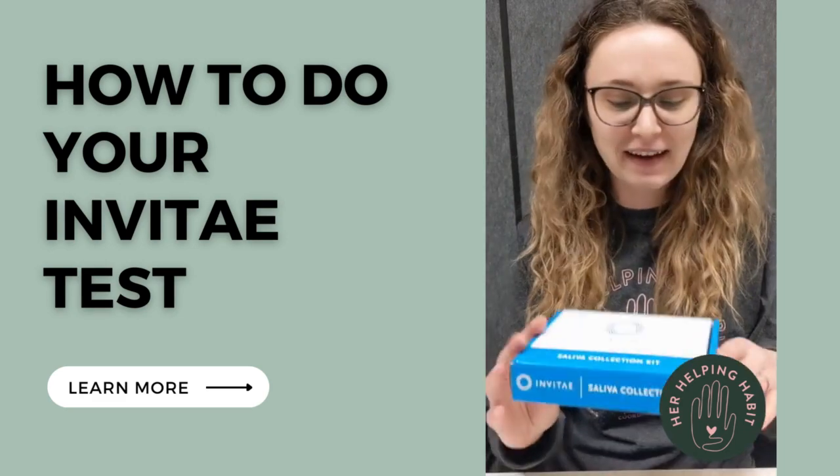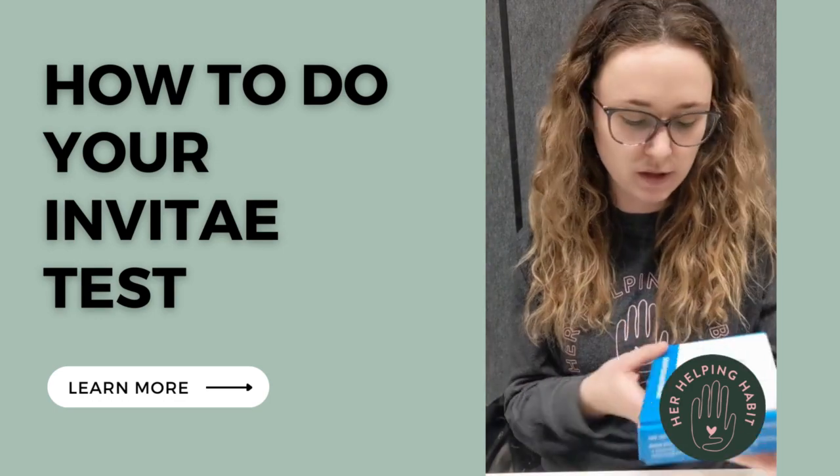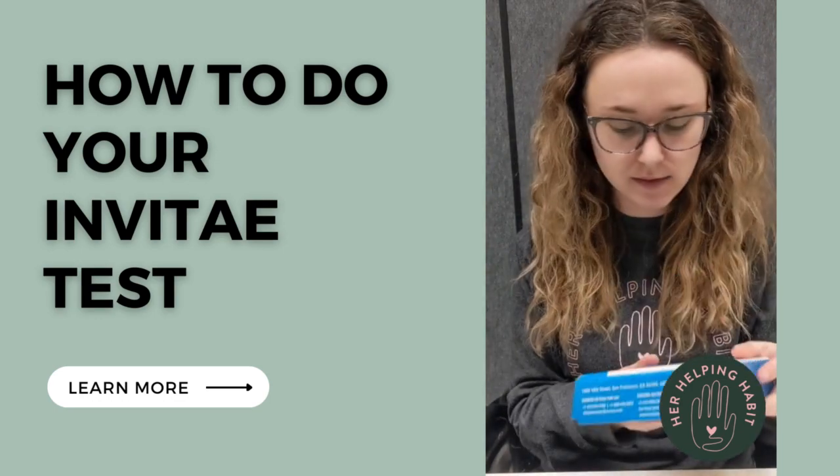Hi donors! I've got a genetic test here from Invitae and I'm going to show you really quick how to use this.